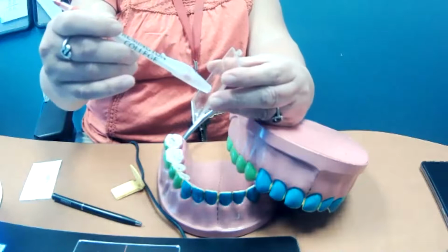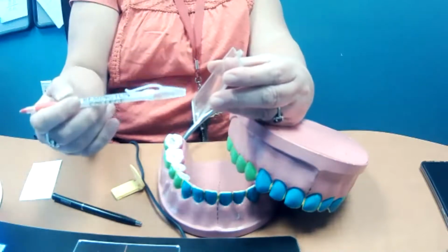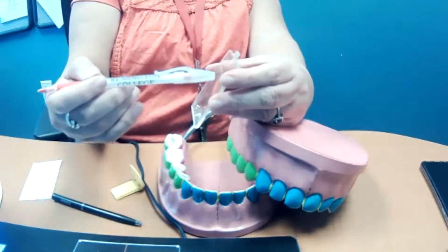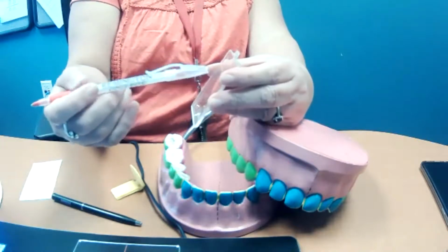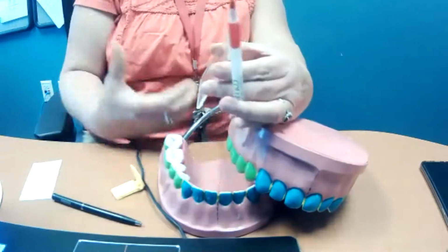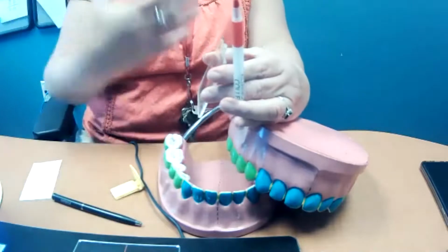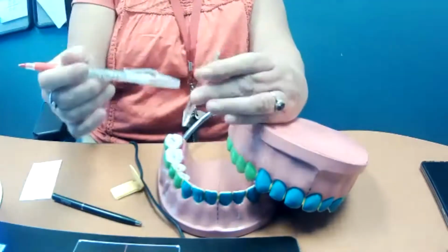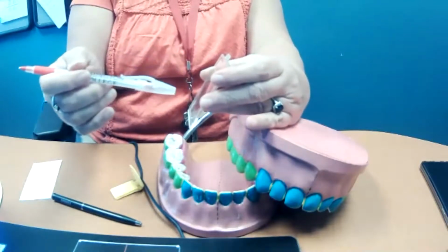From the other standpoint, if I have too little angulation and I come from down here, it's going to make my tooth look too long, right? The same thing in the selfie. If I bring my camera all the way down here and I shoot up on myself, then maybe my head will look really long, or it's going to distort me. So there's a really fine technique in taking a selfie.